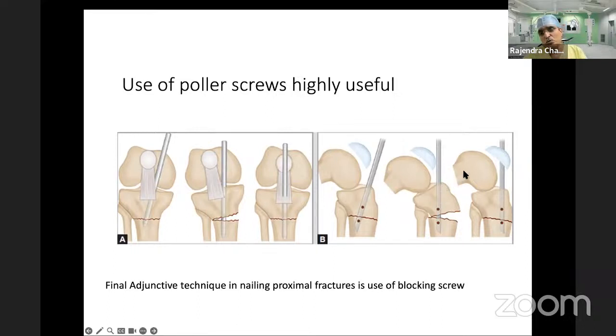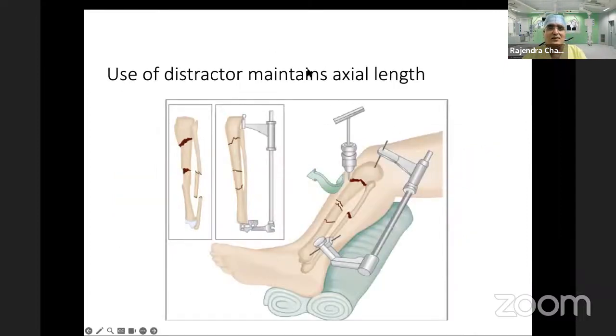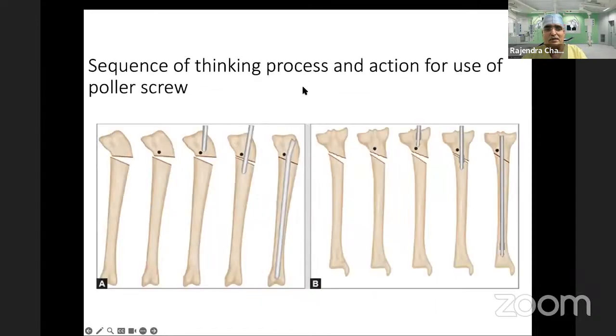I also like to use two 2.5 or 3mm pins, and keep this fragment well opposed to the main fragment. That also is a very useful tool. So take two pins away from the zone of the nail and keep it well opposed. A distractor is another beautiful thing.